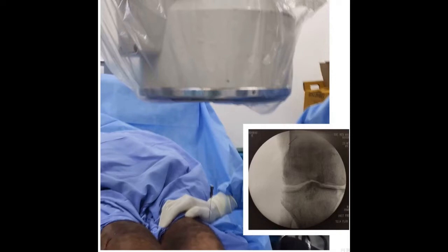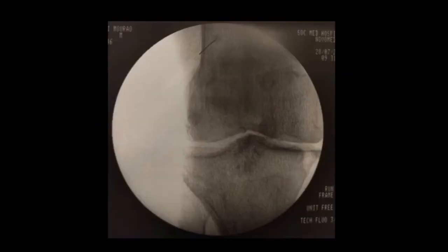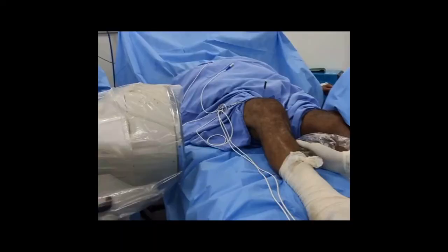The cannula is placed over the skin in line with the lateral cortex, at the transition from the diaphysis to the metaphysis of the distal femur, under fluoroscopic control in anteroposterior view. It is then introduced close to the periosteum, in a posterior direction for 2-3 cm.